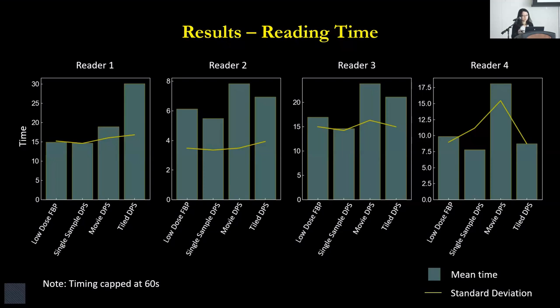We see that the multi-sample display method does take longer to complete. On average, it takes 30% to over 100% longer than the single sample method. However, which strategy takes longer and how much longer it takes is also dependent on the observer.